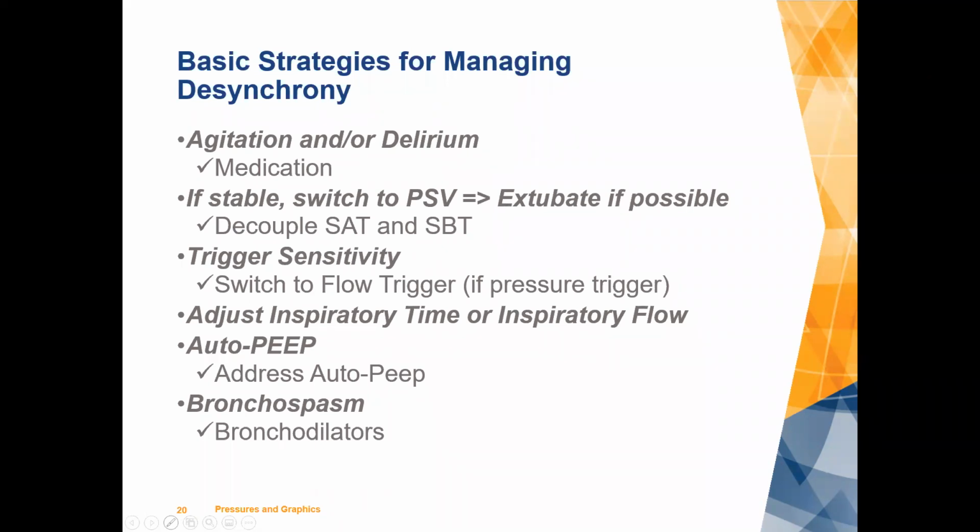Trigger sensitivity: switching to a flow trigger, but again, flow triggers are much more common than pressure triggers today. Adjust the inspiratory time and inspiratory flow, and it really is getting your scalars up there. Pulling the scalar up and adjusting your I time, maybe to allow for more E time. So, if you will, shortening the I time, increasing the flow, delivering the breath more quickly.